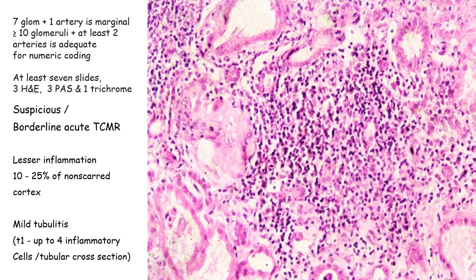In this photo, you will be able to see that we have a large cluster of lymphocytes present in the center, almost completely overwhelming the tubules. At the periphery, there are a few singly scattered cells and smaller clusters.